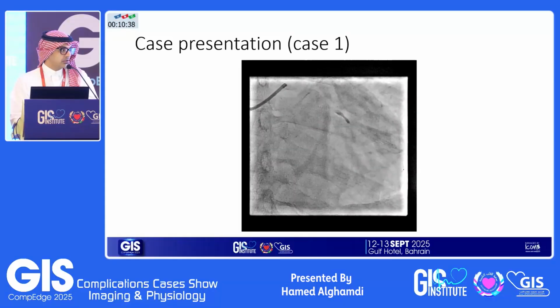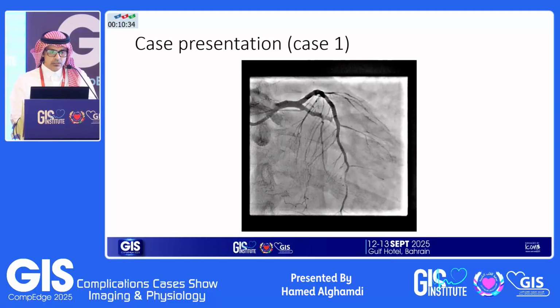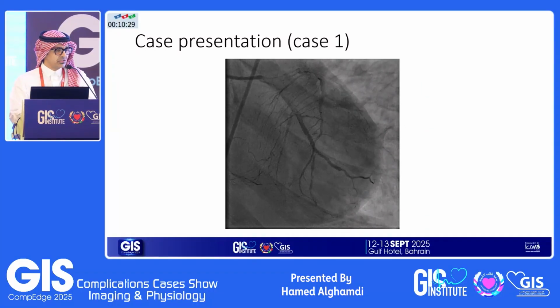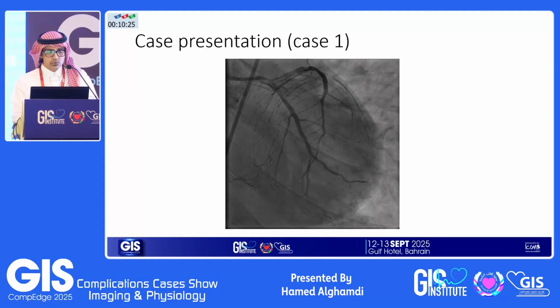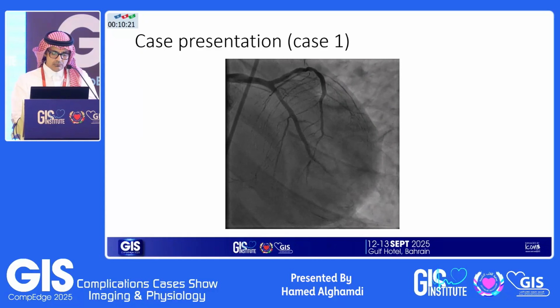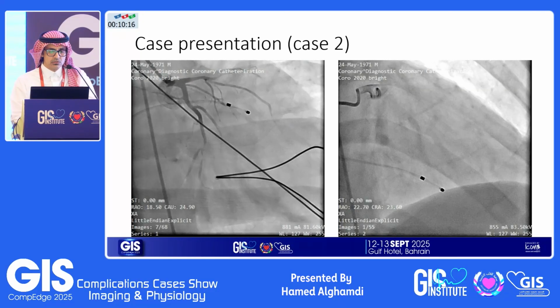The good thing was that he had distal collaterals to the culprit artery, so I hoped that would maintain viability of that vessel. We decided to go with the deferred strategy, brought him in after 48 hours and put in a stent. It was straightforward. Luckily, it's open, and this is the best we can offer this patient, I think.